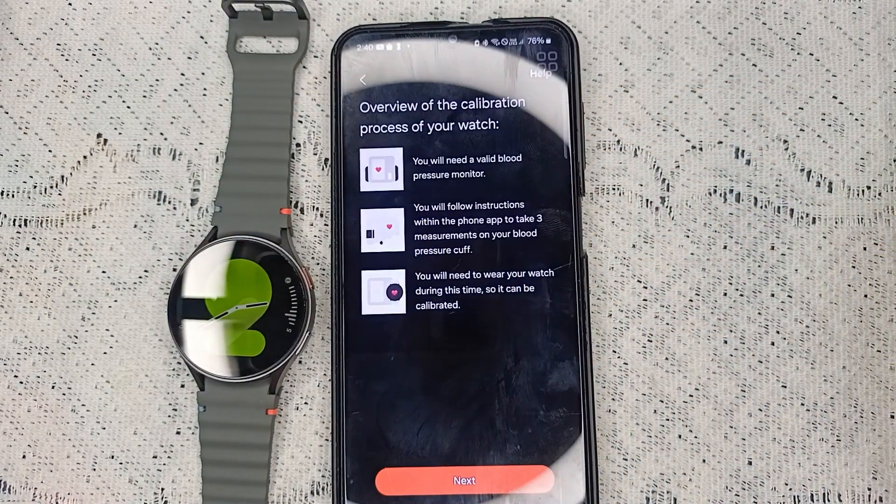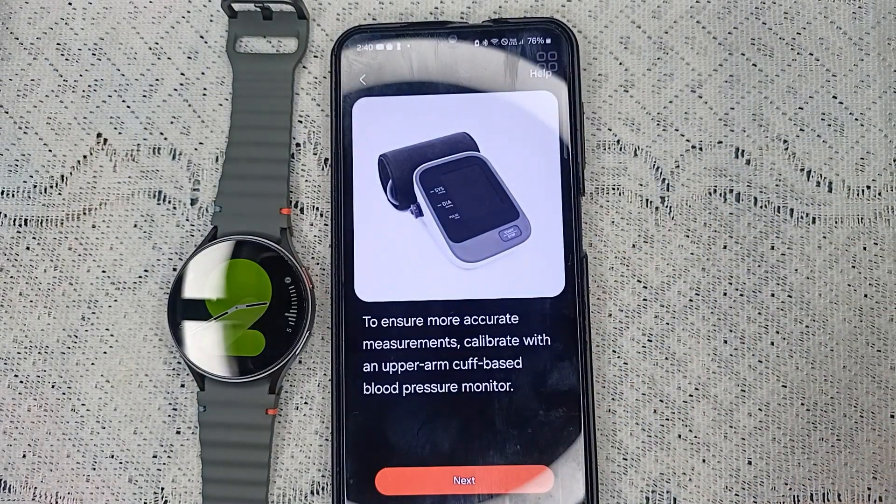It will give you an overview of the calibration process. You will need a valid blood pressure monitoring machine, follow the instructions, and wear your watch. It will also ask you to ensure more accurate measurements and calibrate with two upper arm cuff-based blood pressure monitors.